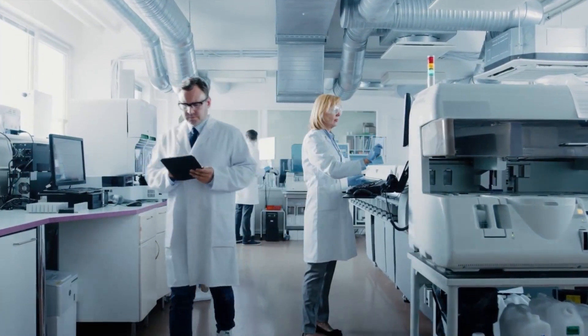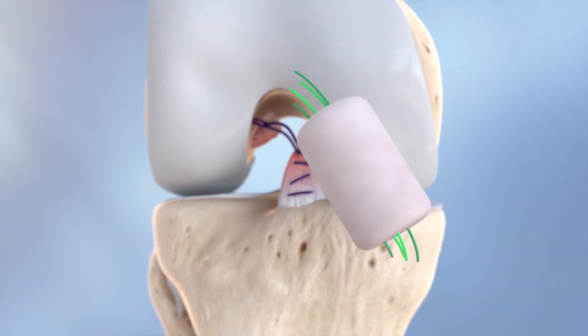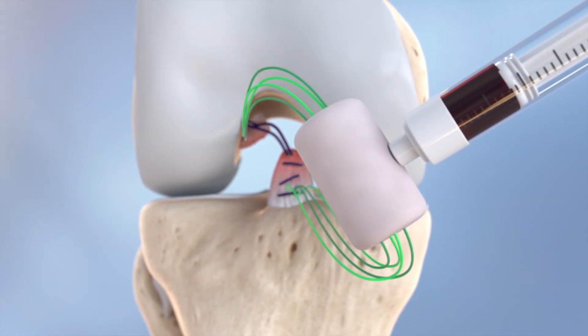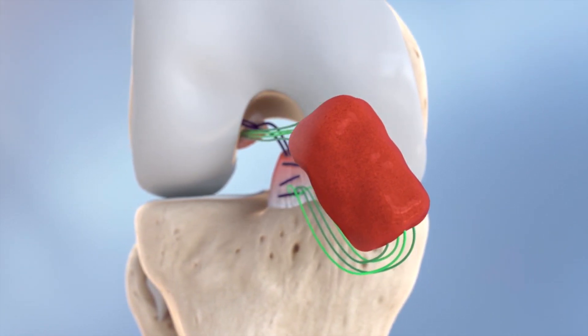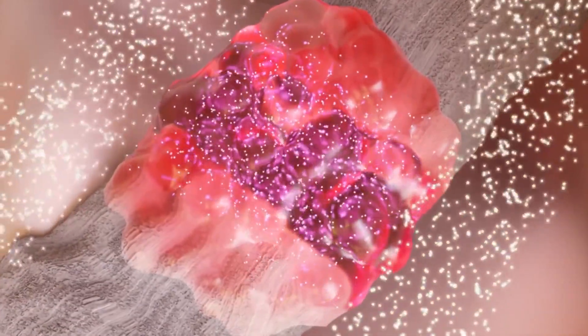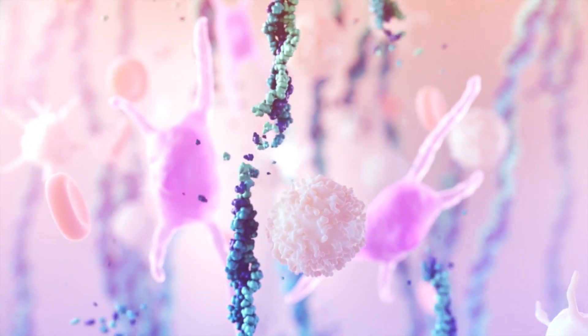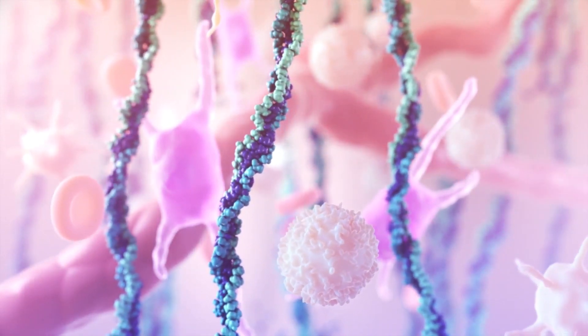So the BEAR is a Bridge Enhanced ACL Restoration — that's what it stands for. Basically, it is a way to repair the ACL. ACL injuries are very common in the U.S.; there are probably about 400,000 operations performed every year — one of the most common in orthopedic surgery. Traditionally with ACL tears, we would have to go through a reconstruction where you'd take ligaments from other parts of the body. But the BEAR is the first time where we're actually able to repair the ACL. We stitch the ACL back together and use a biologic dressing to create an environment where the ACL can heal itself, which is really new in the ACL world.